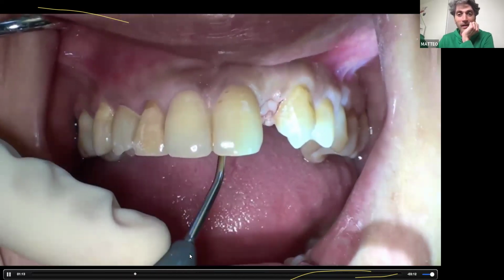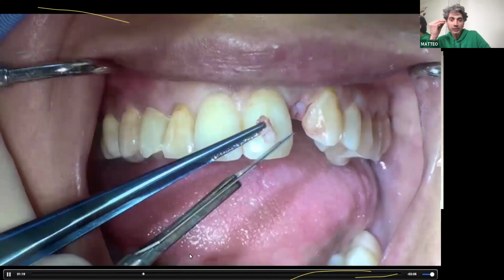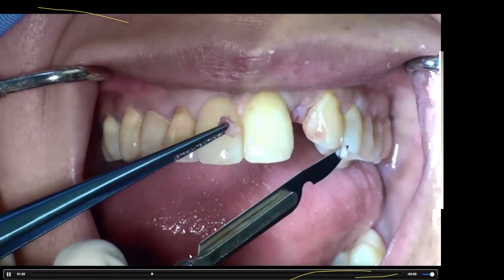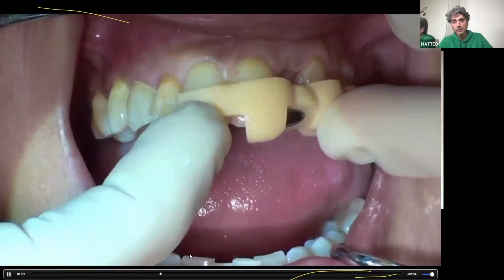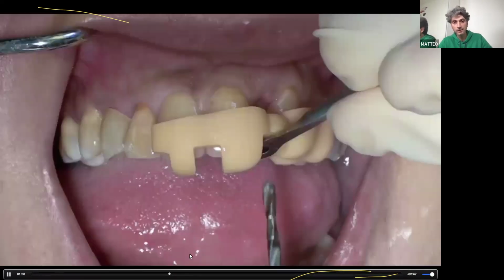So here the surgical guide helps you not to open a flap. И что еще важно, хирургический шаблон позволяет вам работать безлоскутно. It's very important because if you are going to reopen a flap, you can lose some papilla height.